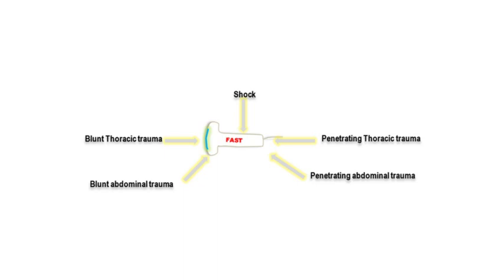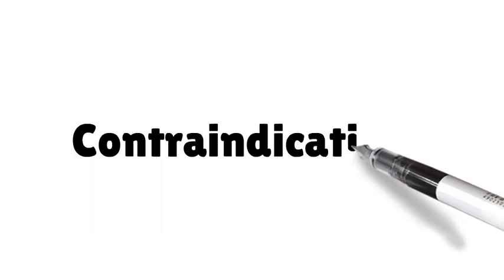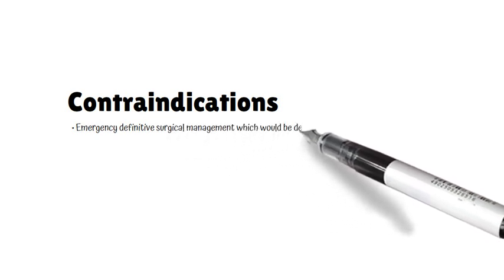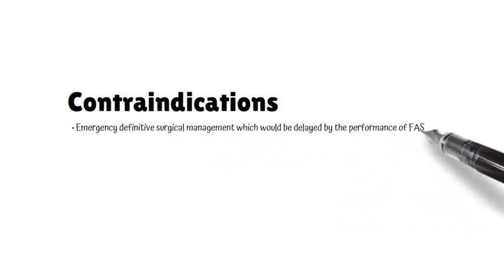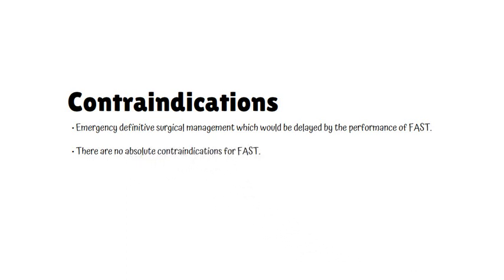What are the contraindications? There are no absolute contraindications for FAST. FAST is usually contraindicated in an emergency situation which obviously needs surgical intervention, and that surgical intervention is going to be delayed by the performance of a FAST.